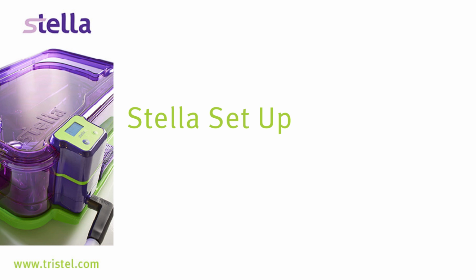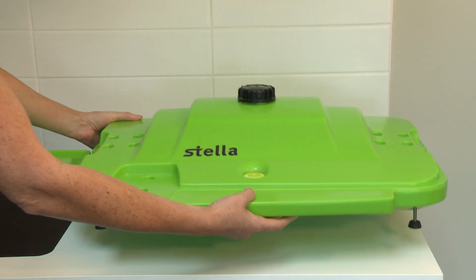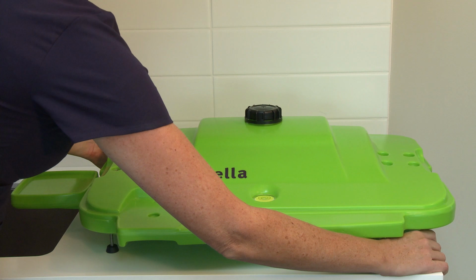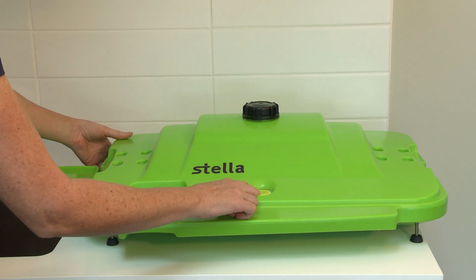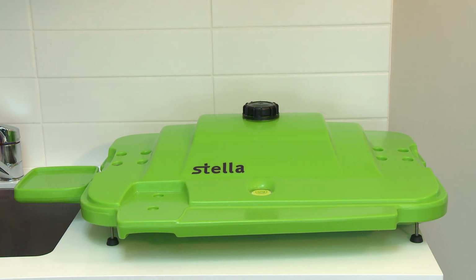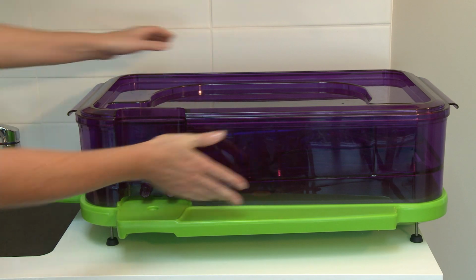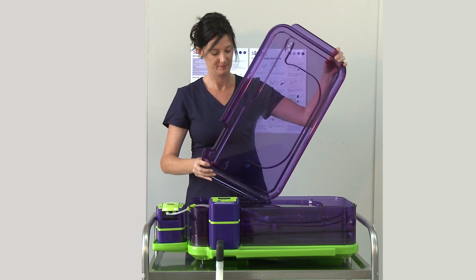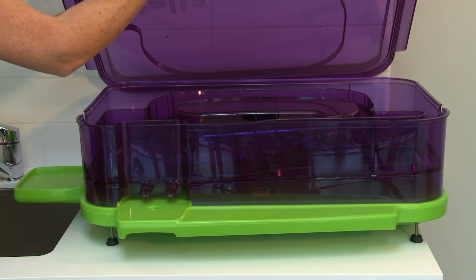Stella Set Up. We will now summarize the parts and show how the Stella disinfection is set up ready for use. Set the cradle up level on a bench close to a sink and check the spirit level. The bubble needs to be in the center. This indicates that the cradle is level. Place the base on the cradle. Stand the lid in an upright position at the back of the base if wall height allows. If not, position behind the cradle.